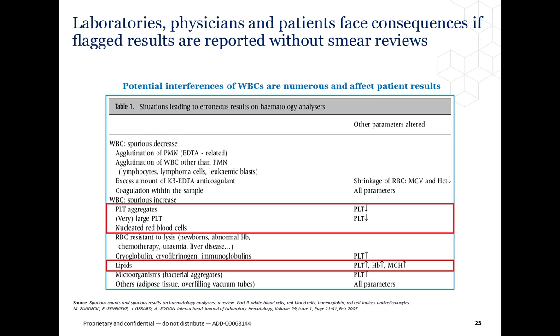Some of these interferences will never be resolved because they are either pre-analytical problems that may have occurred in collection of the blood sample, or could be a condition that would create problems such as high lipids or even clumped platelets. So really, instrument methods, research, and development are where we continuously try to make strides in minimizing the impact of these interferences. Surprisingly, some of these have been resolved, but many of them are still unresolvable.